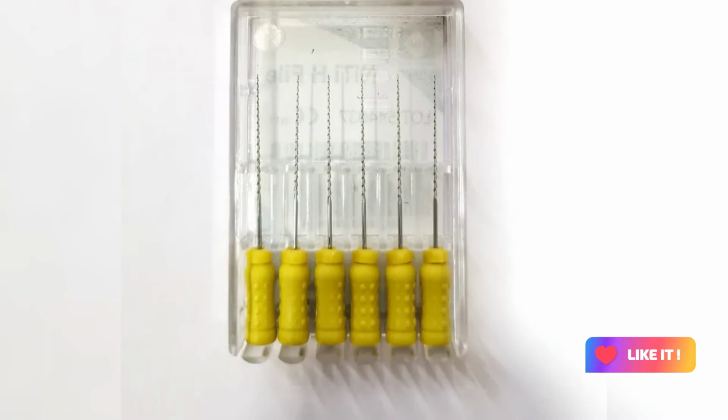Ideally, those instruments are made for single use. Why are we doing it for 20 times in India? Cost, right? How much does a file cost? One full packet costs around 1500 rupees. Why not add it to the cost of the treatment? Take that money from the patient and use only one file per tooth.